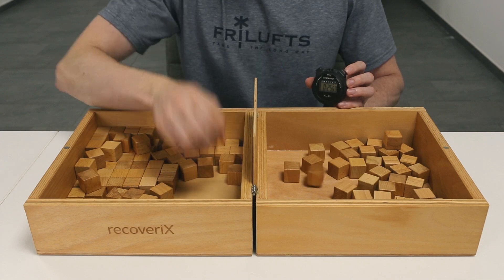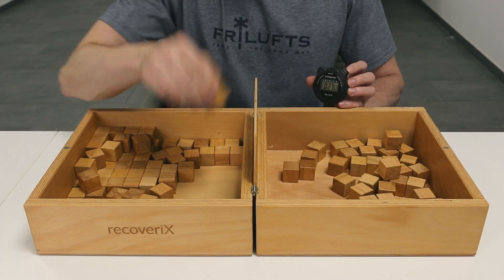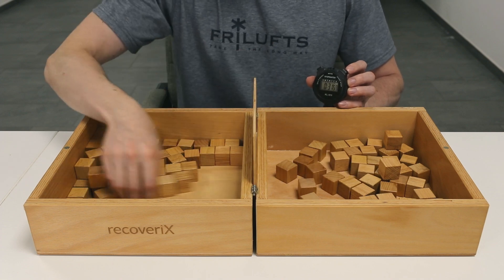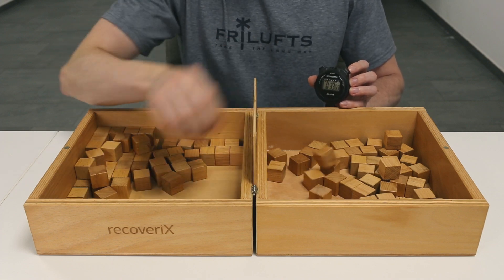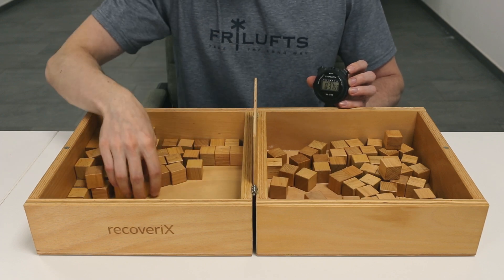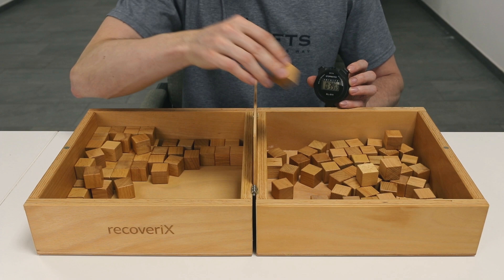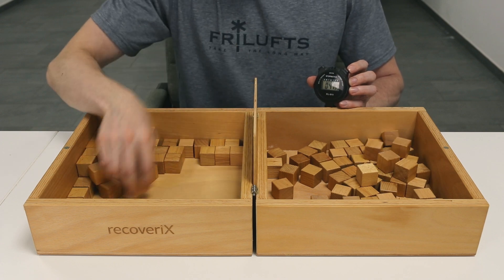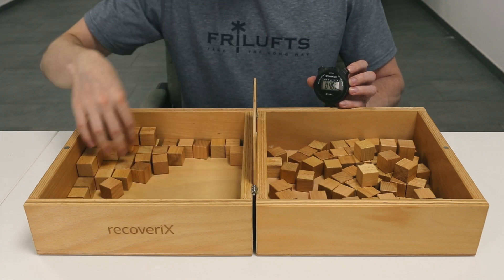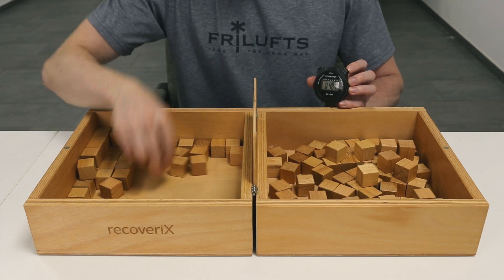To administer the test, the examiner is seated opposite the individual in order to observe test performance. The starting position of the patient's hands should be to the sides of the box, and only once you give the go signal should the patient start. Give the patient a 15-second practice trial which is not scored. We recommend using the instruction 'ready, go' instead of counting 'three, two, one, go,' as patients may already start moving at 'one.'